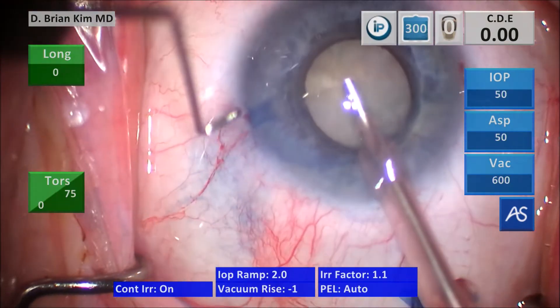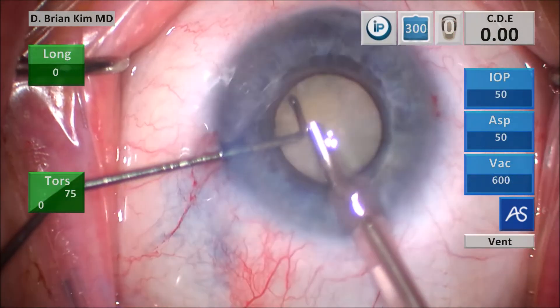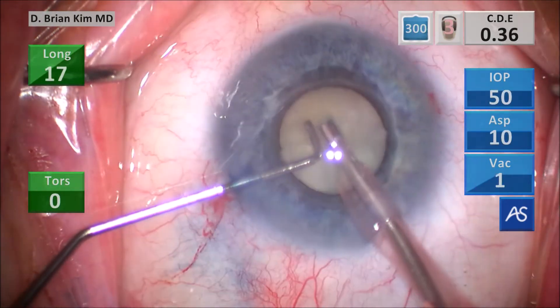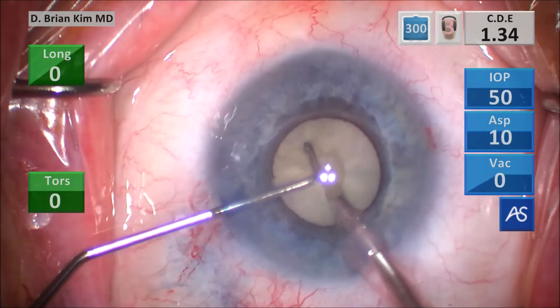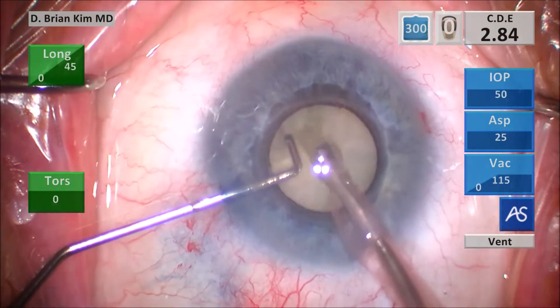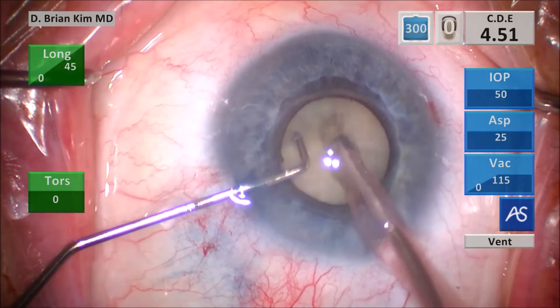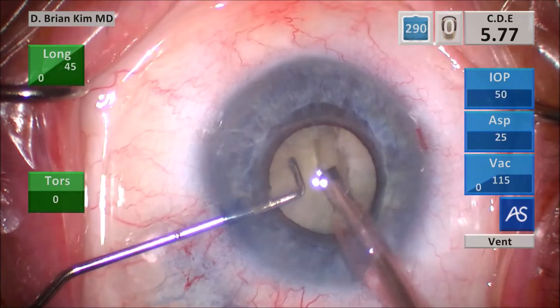Lifting the incision with the chopper, going in with irrigation off to minimize Descemet's trauma, removing the surface epinuclear material, turning the bevel up, then I switch to dense mode and start sculpting a central trough. You can see there's some density to this lens. When dealing with a dense lens like this, there's a chance you'll get a posterior plate phenomenon. Rather than struggle with that, I'm going to perform a terminal chop technique, which will overcome any potential for a posterior plate phenomenon and allow me to easily disassemble this lens into two hemi-nuclei.